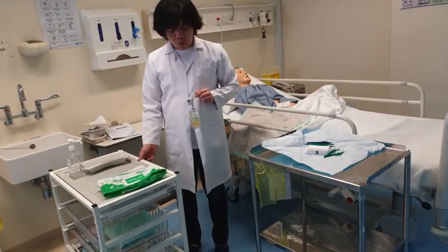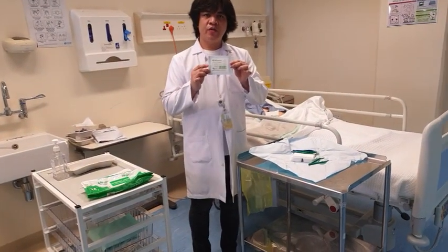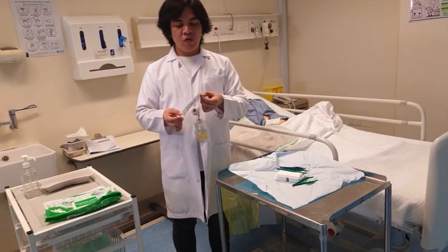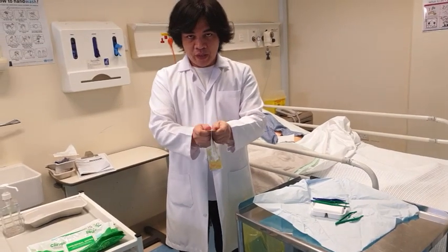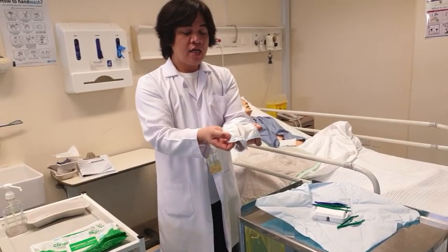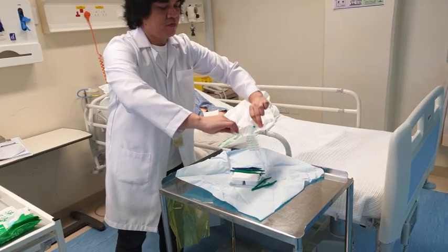Now I'm going to prepare the wound dress. This is a sterile package, so that means I cannot touch the inside part. So what I'm going to do, put the content there, locate the flap, open it with your thumb, and you will see the dressing, but you're not supposed to touch it. Instead, turn it upside down and drop it into the center.